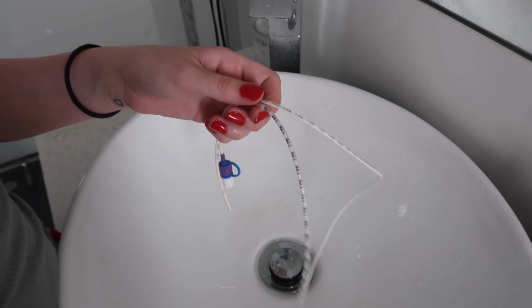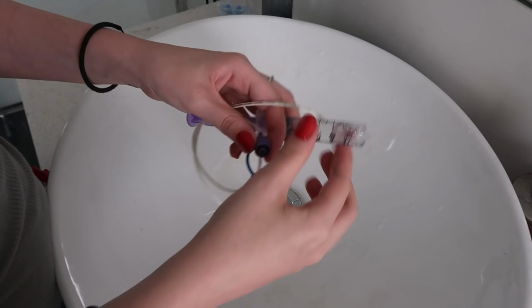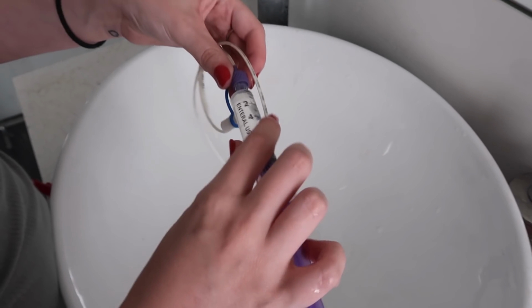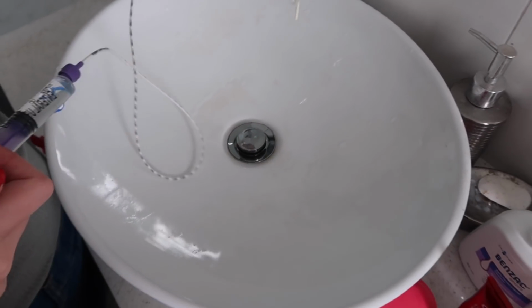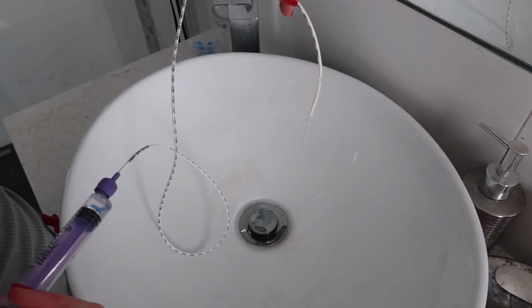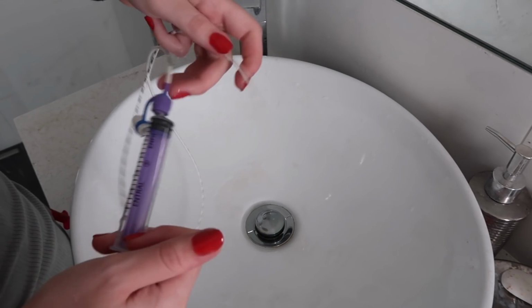And then I'm going to take the syringe that I showed you before, and this is the sterile water that we got from the jar, and we're just going to flush it through the tube, because anything that's been inside it now, you want to get out. You see all that stuff coming out? That is going to be bile and stuff from your insides. So you want to make sure you get all that stuff out.